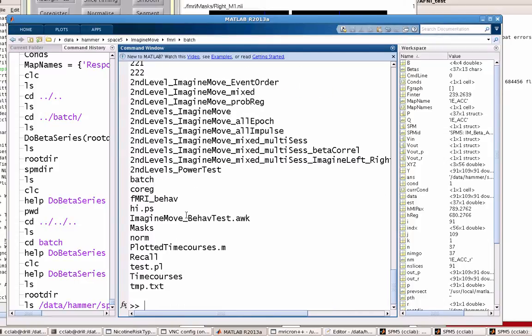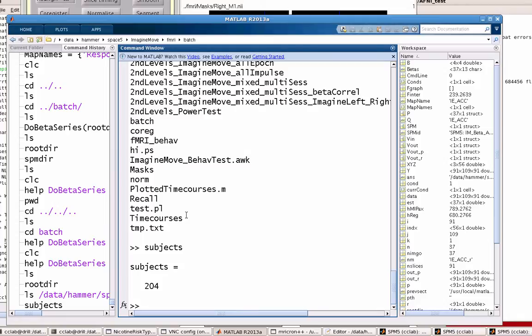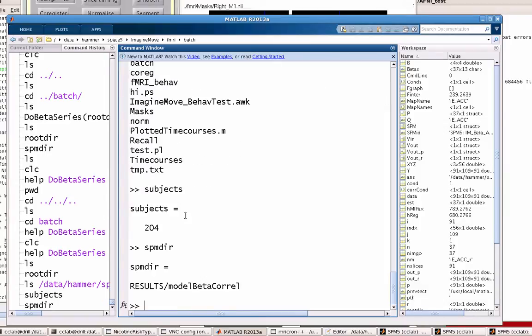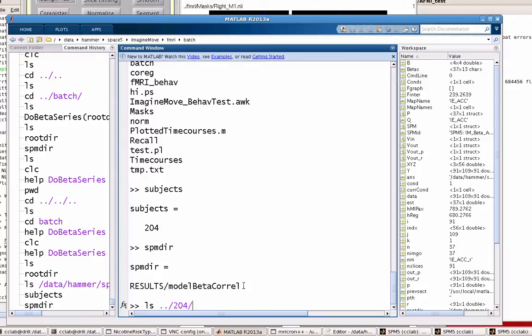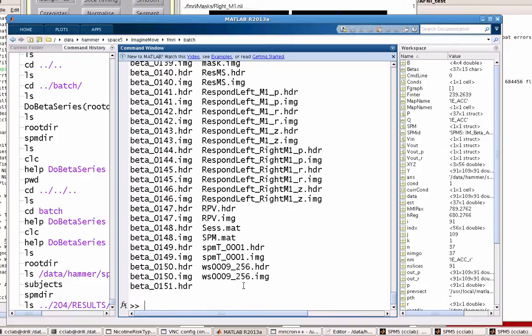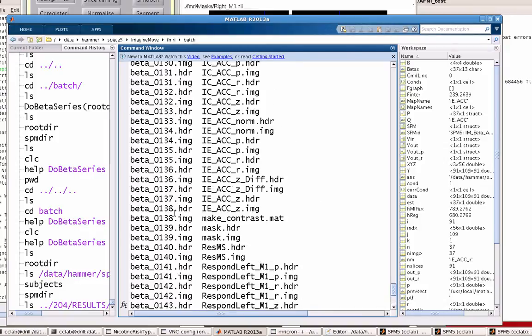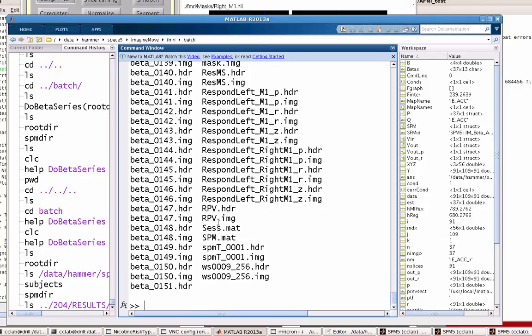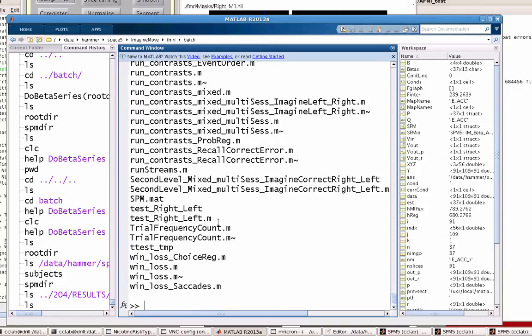The next thing is subjects. So how many subjects do I want to loop over? And I could make this a bunch of people. I could make this 204, 205, 206. I could make this everybody as long as they're enclosed in brackets. But for now, we're just going to do it for one subject. And lastly, spmdir is where it points towards the spm.mat, which has all the individual betas estimated for a specific condition. So within one of these subjects, we have model_beta_corel. That's where the spm.mat file is located. It has a bunch of betas, a ton of betas. In this case, I actually did an individual beta for each trial of each condition. You don't need to do it for each condition. You can just do it for each trial, each occurrence in the condition that you're interested in, and then model the rest of them normally. But anyway, so that's where everything is pointing towards.